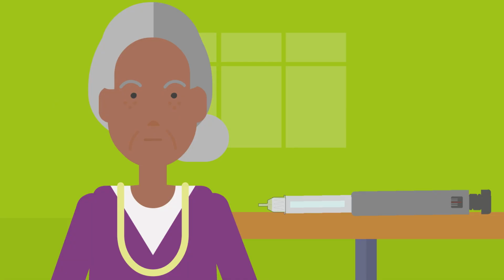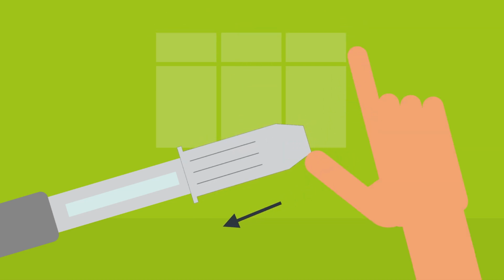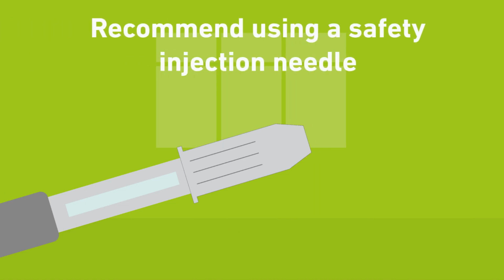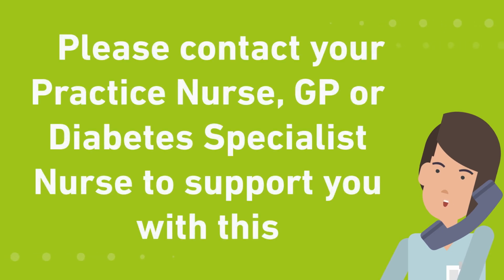If someone needs to support you with your injections for insulin or GLP-1 and a safety pen needle needs to be attached or taken off, it is recommended that they use a safety injection needle. Please contact your practice nurse, diabetes specialist nurse or GP to support you with this.